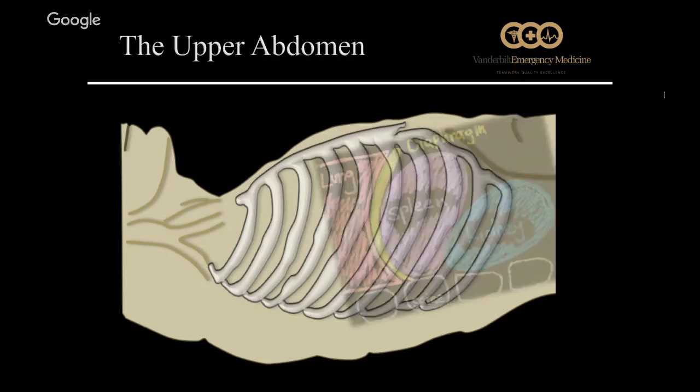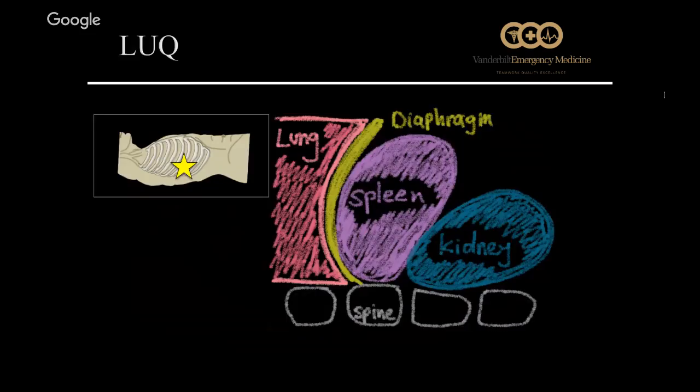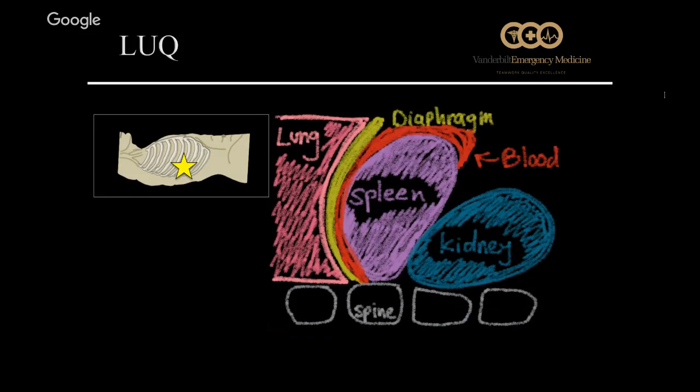So like I said, a little closer to the bed, a little closer to the head, knuckles on the bed, bring the probe up against the patient. We're going to scan to look for the spleen, but rather than looking between the spleen and the kidney, I'm going to look for free fluid along the dome of the spleen, coming up along the spleen tip. Next slide.